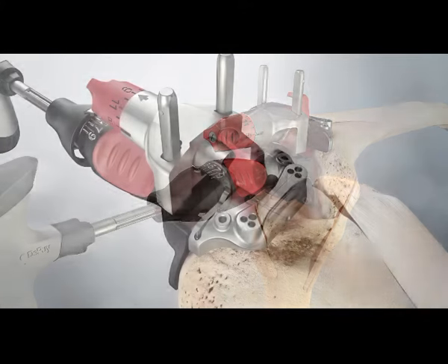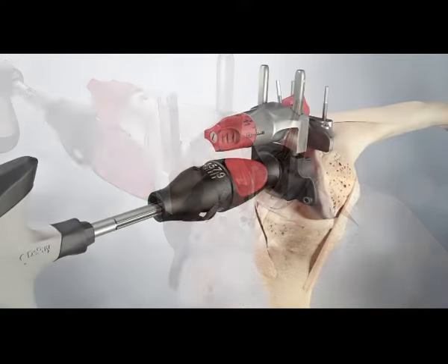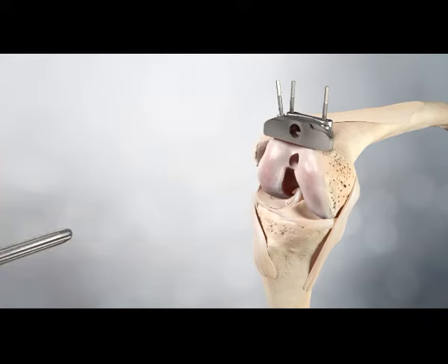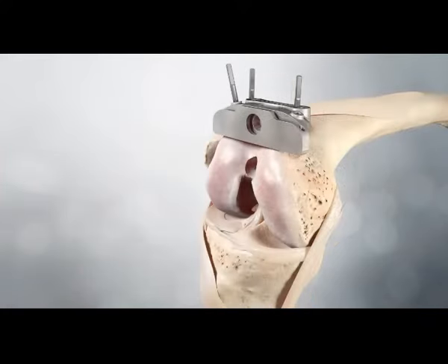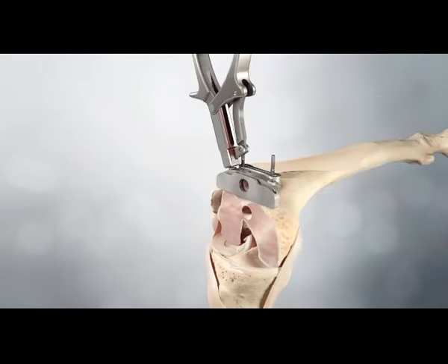The cutting block rotates until it rests on the anterior femur. It is secured to the femur with two pins through the centreline holes; an optional third pin can be used. Remove the jig from the cutting block using the red cutting block clip. Resect the distal femur. Pins can be removed using the pin jack.